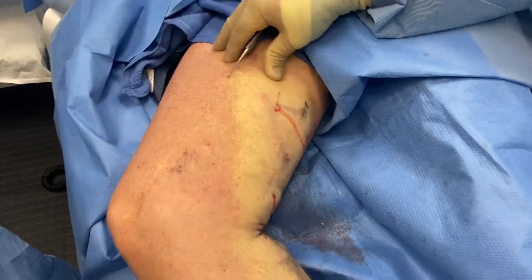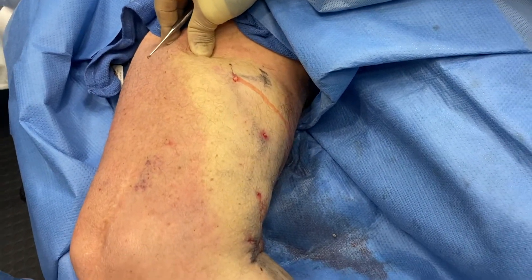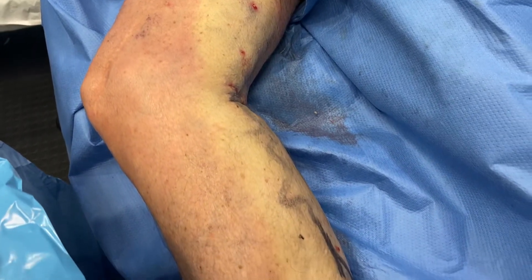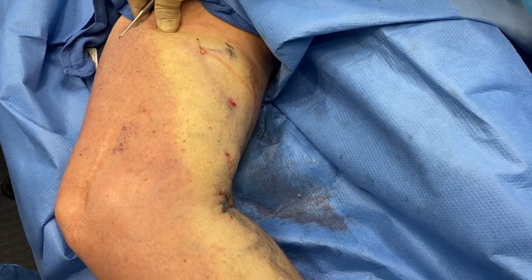At this position there was a large varicose vein, and you can see how basically through some very small prick holes the vein is hooked and then tugged out, and basically taken all the way out from top to bottom. So it's a very quick way of treating a longer, larger vein segment.